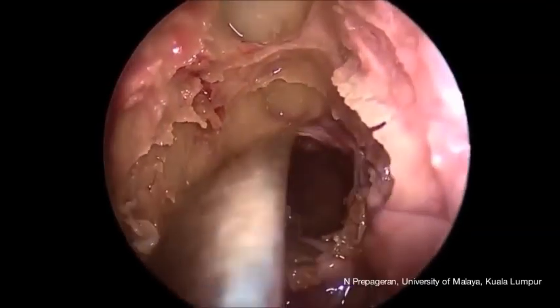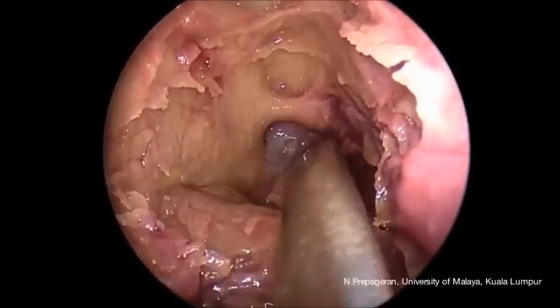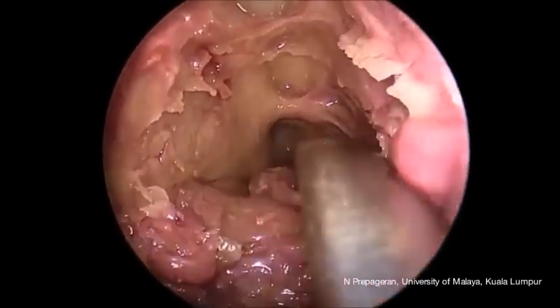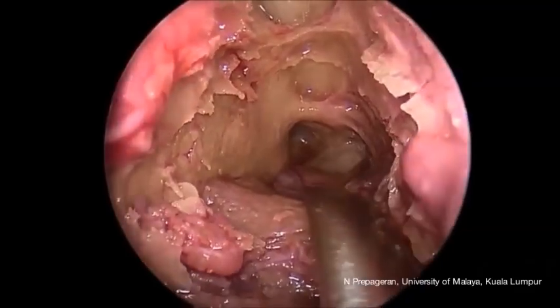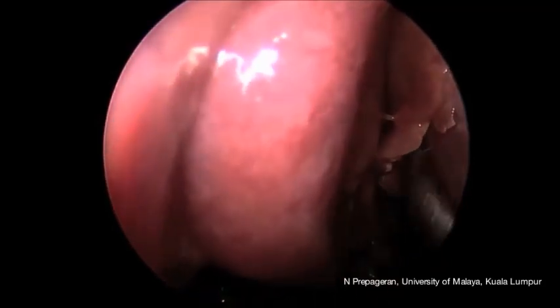And this is the posterior ethmoidal cavity or sinus with the mucosa inside the cavity itself. We are peeling off the mucosa from the posterior ethmoidal artery. You can see the multiple branches of the posterior ethmoidal artery as it goes into the turbinate. And how do we confirm that that is the posterior ethmoids? The easiest way is to look for the superior turbinate.